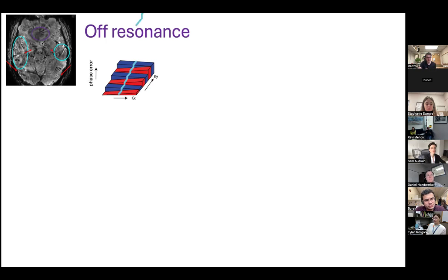The cause of these issues, however, comes more from the edge of these lines, because here we have no additional phase error every other line, right? And then we have a sudden jump. When you have these inconsistencies that are not smooth across your phase encoding direction, but only for every other line, you have Nyquist ghosting, specifically high spatial frequency Nyquist ghosting at the edge of the lines, right?